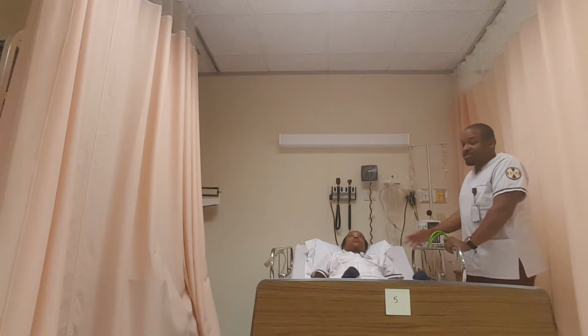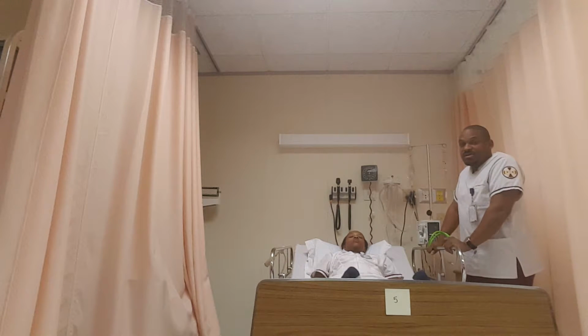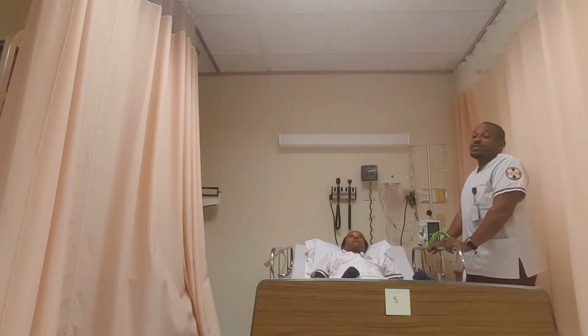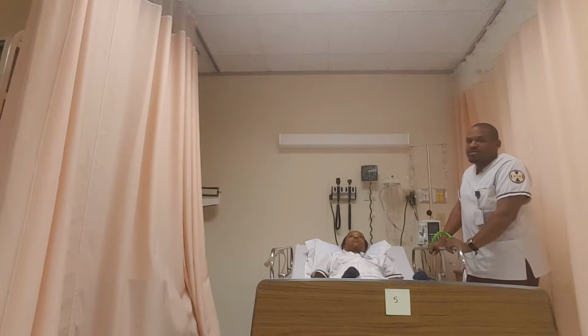Patient has no respiratory distress, non-labored breathing, no accessory muscles are being used. I would also check the mask fitting, make sure the mask or the nasal cannula is fitting appropriately, and that there's no skin breakdown or irritation where the mask meets the face.